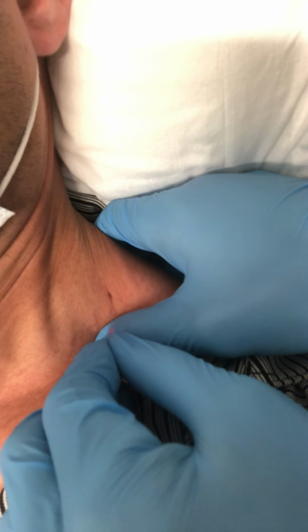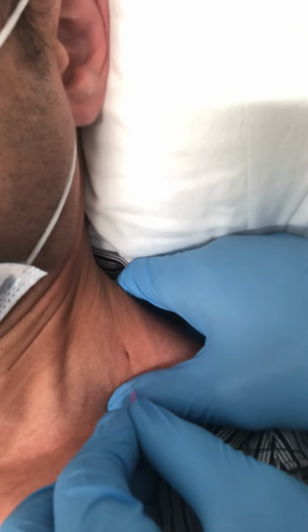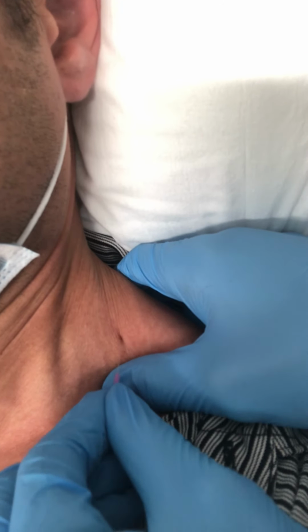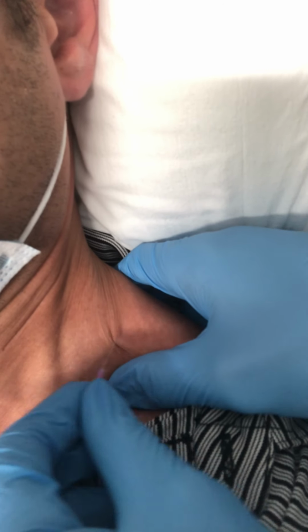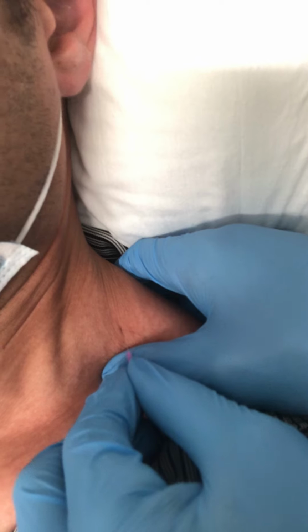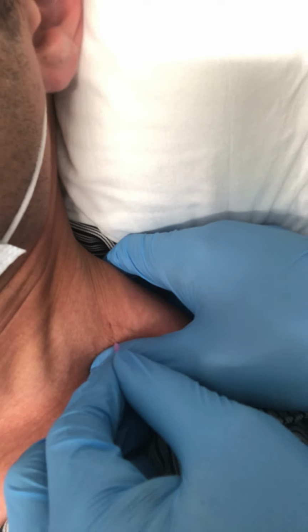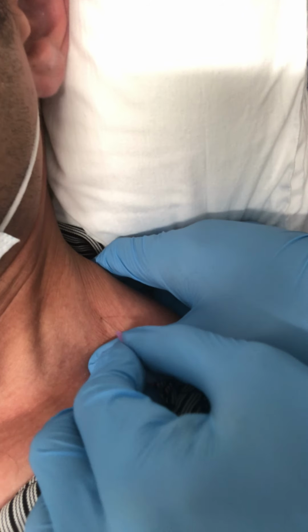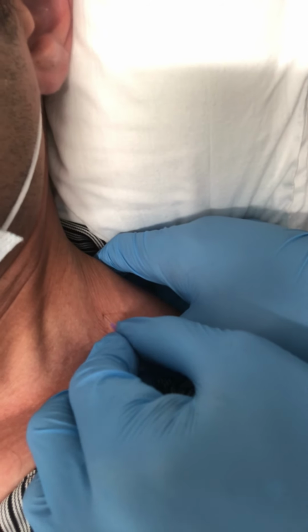Oh yeah, they're feeling. I don't know if you can see it on camera, but I definitely felt a twitch there. So we're kind of scanning the area here. John, what do you feel? So I definitely feel that needle grab into it a little bit. Okay. What Sean's doing right now is called scanning with the needle. So he's looking for tight bands of tissue.